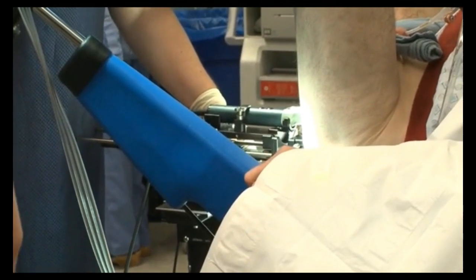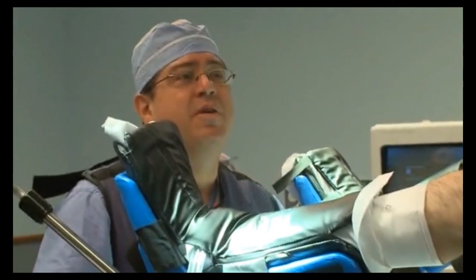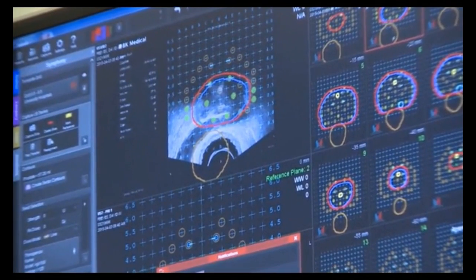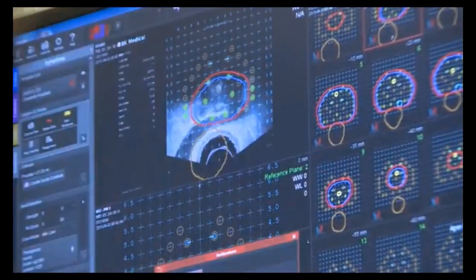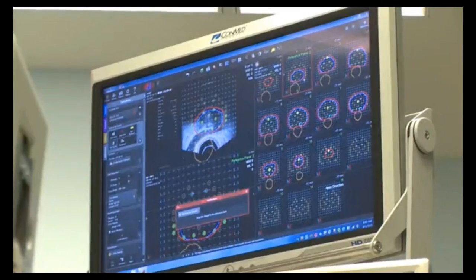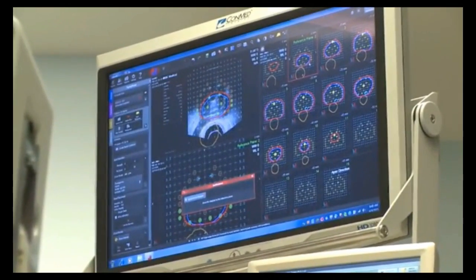Let me see your image versus my image. I want to see your contours and I can match to you. What we're seeing here is the contours from his MR plan superimposed on the live ultrasound. I can see the prostate is pretty close to where it's supposed to be. I want to adjust that just a little bit on this slice to get the ultrasound right where it's at.